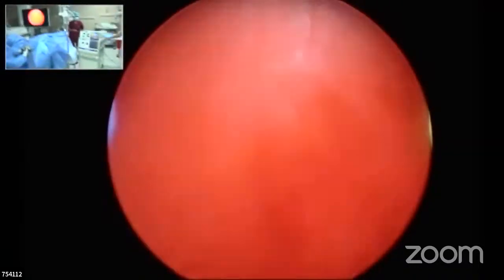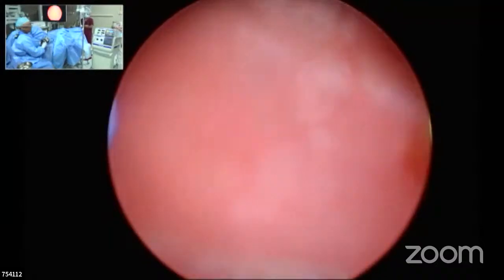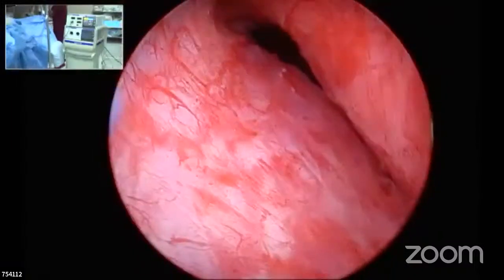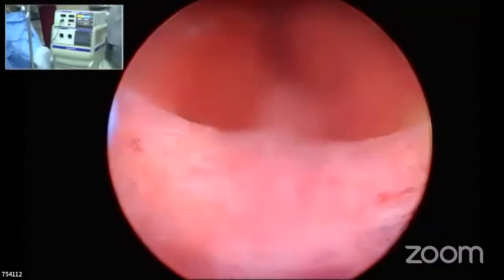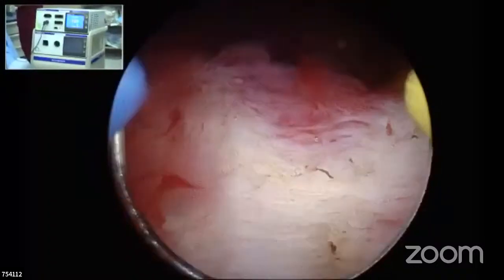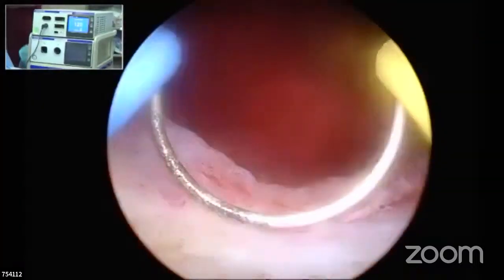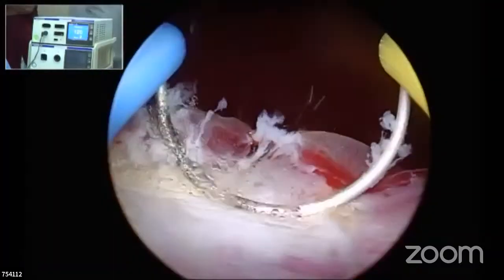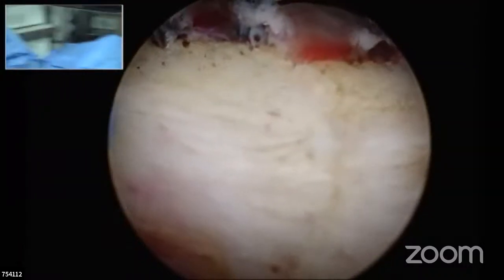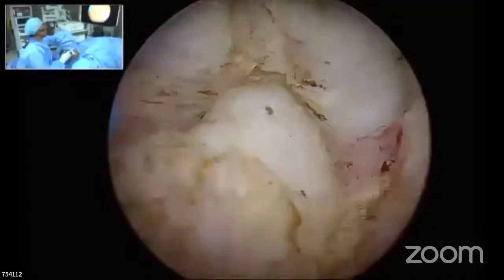Okay, that is typical. 200 for cutting and 120 for coagulation. I have the bipolar installed. They have a setting of 1 to 5 in coagulation and 1 to 5 in cutting. So in prostate, we keep 4 or 5, whereas in bladder tumor, we keep 3 and 4. So that is the way you can adjust your settings, and that is our practice. I thought I'd add that Storz also has a bipolar, and I'm routinely using it for many years.